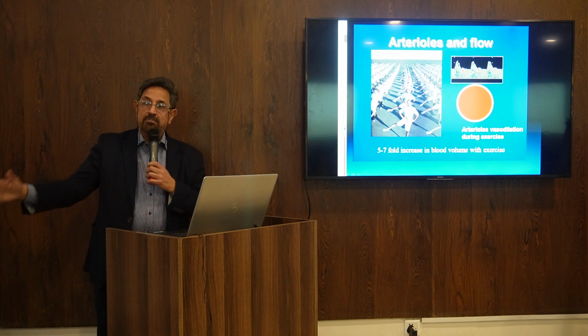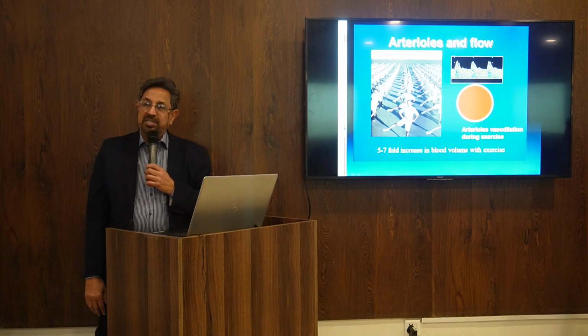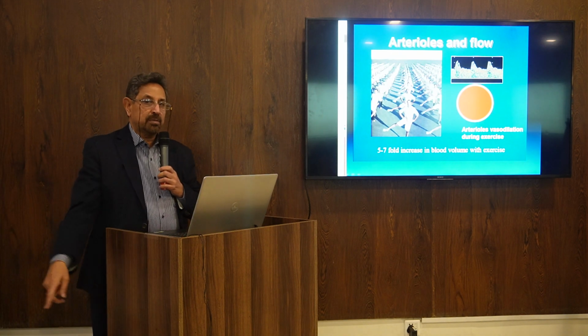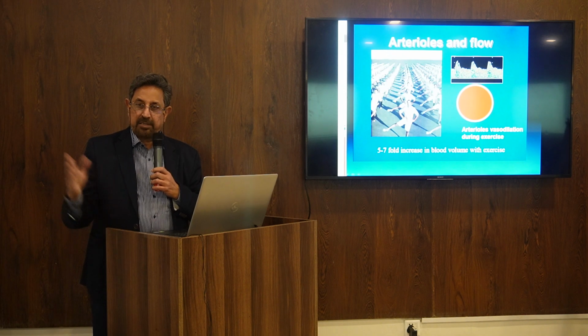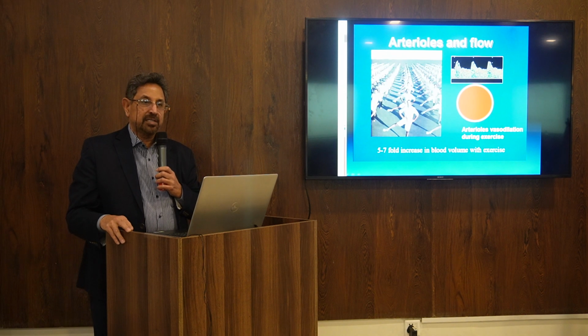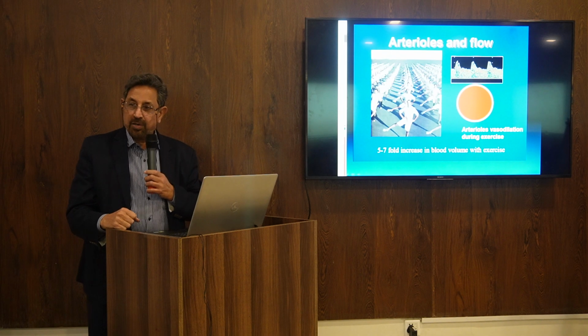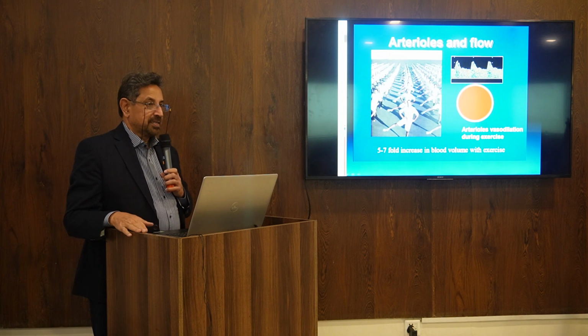The patient has come after walking 200 meters and you immediately lie them down, because you have a very busy clinic, and start your scanning and put your probe. You will see there is good diastolic flow and spectral broadening, and you think there must be some proximal stenosis. Wrong diagnosis. The patient must take rest for some minutes.